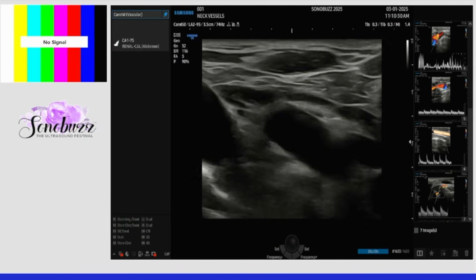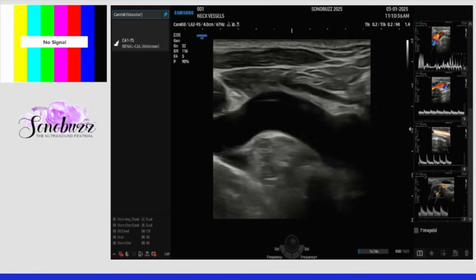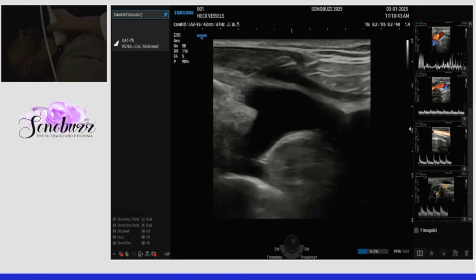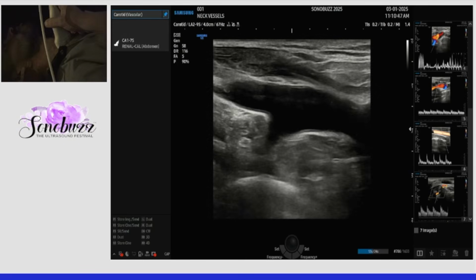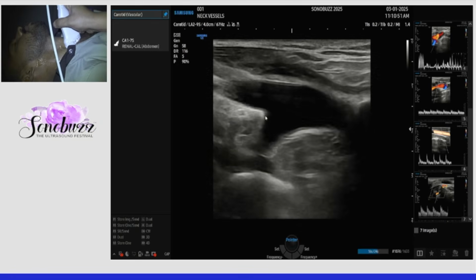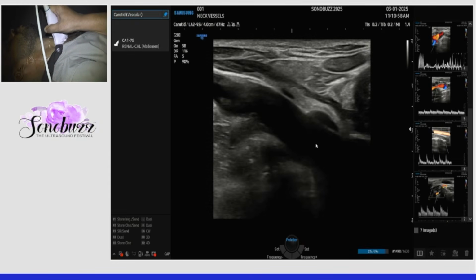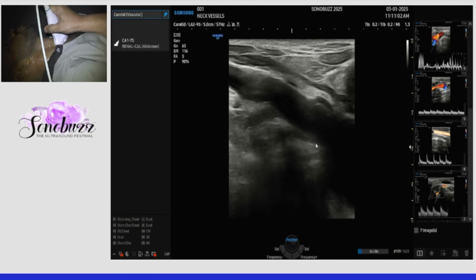Before you proceed, try and see the origin of the carotid, which comes from the brachiocephalic artery, and it will form a nice Y-shaped structure which allows us to understand there is a subclavian and there is a carotid. So there is a carotid here which shows a good IMT, and if you go this side, that is the subclavian artery. If I were to look a little further downwards, I will nicely see the entire aortic arch in cross section.